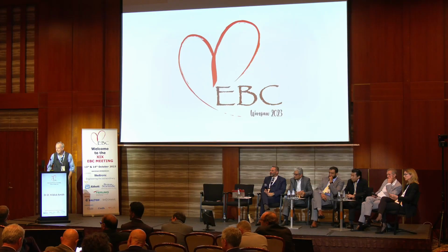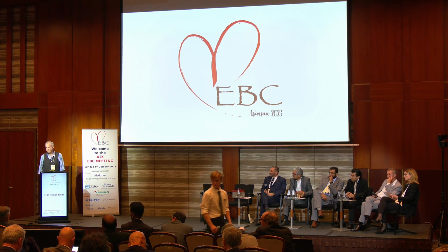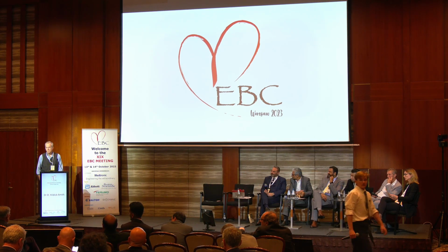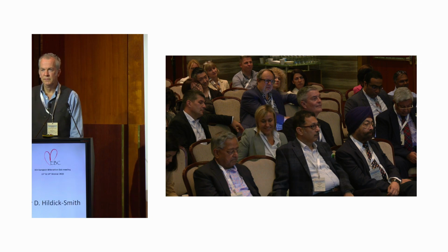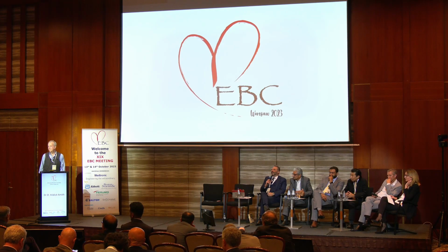Honestly, I would take out proximal LAD, that's a prognostic vessel, and I would concentrate maybe on mid-distal LAD and diagonal and RCA or obtuse marginal. Take out the prognostic, go in the vessels that are treated because of symptom relief, not for prognosis. Sure. We won't do that. But thank you. No, I mean, that's the idea. It's a decision.